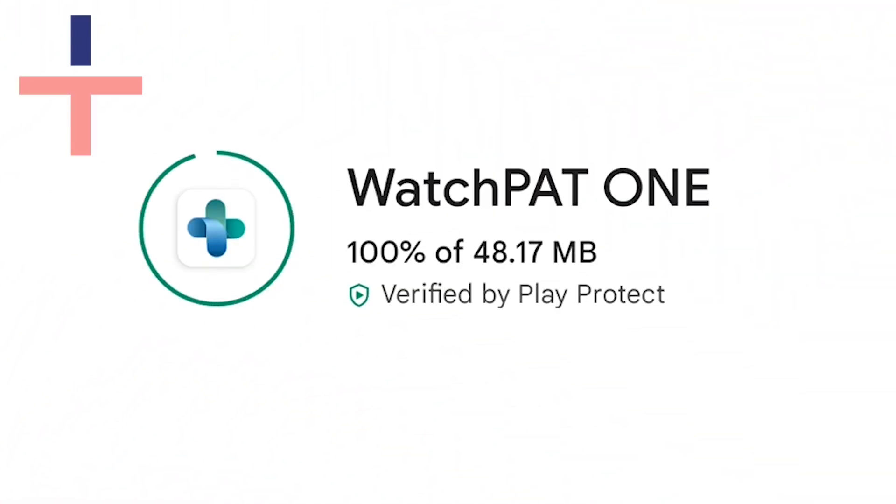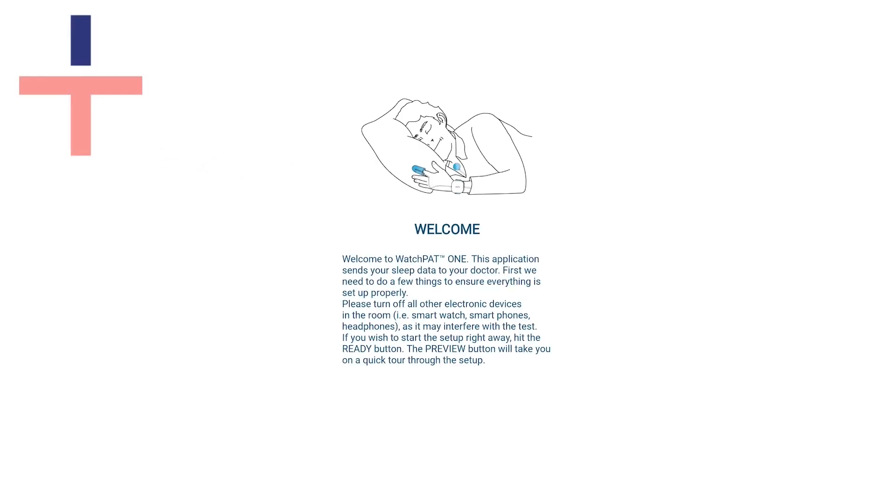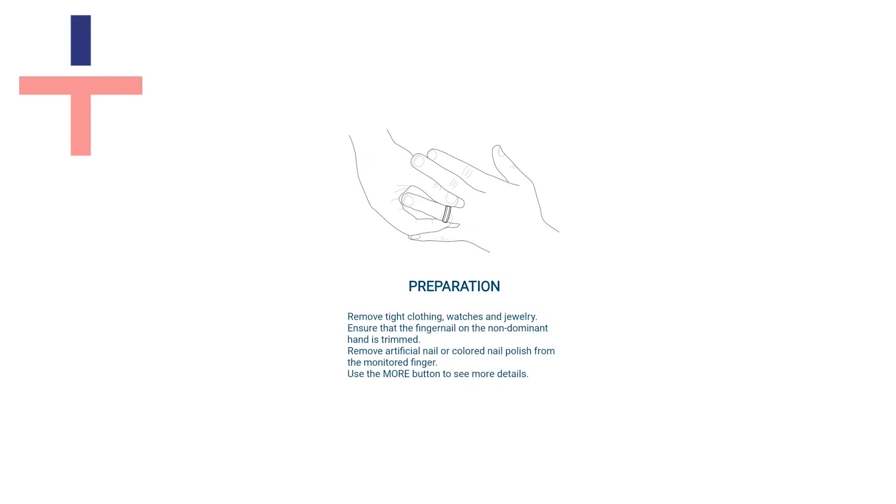You will need internet access to download the WatchPad One app to your mobile device. Once the app is opened and you're ready to take the test, enter the four-digit PIN that you can find in your instructions. The app will guide you through the steps to complete the sleep test.